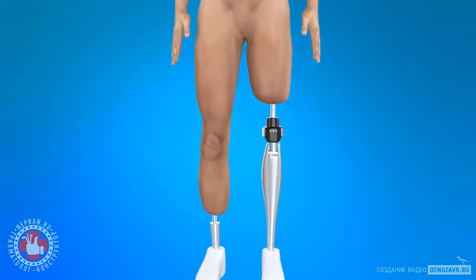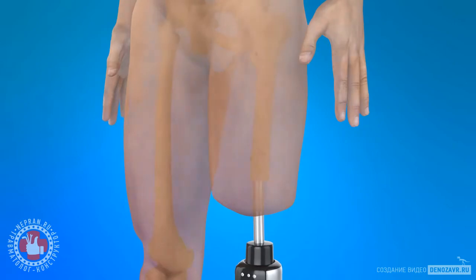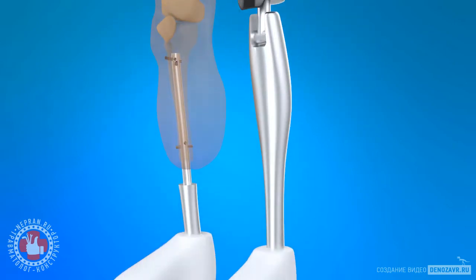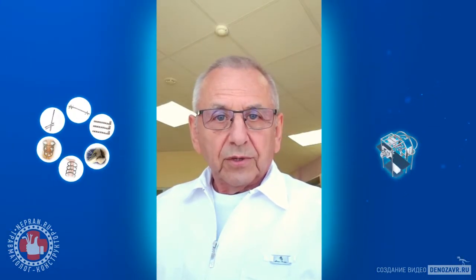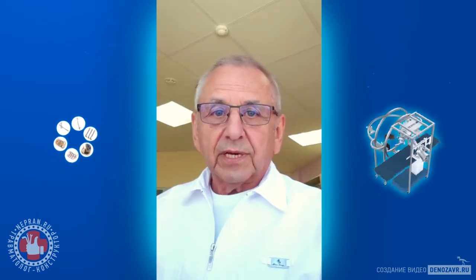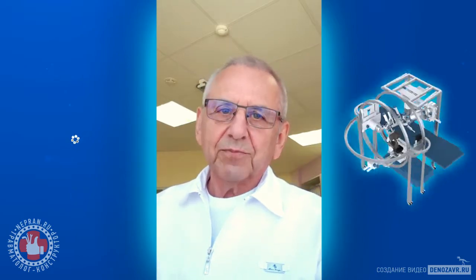And finally, we get a long-term implantable limb prosthesis with the possibility of an early full load, which will save patients from lameness and stump receptors. As the author, I know that the project is ready to be implemented. But now we need a person who could bring it to life, with my help, of course.